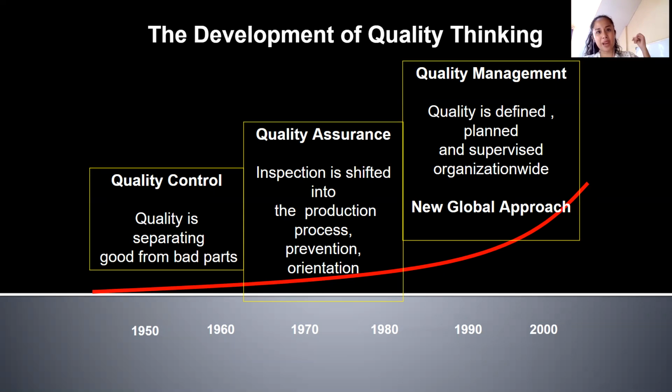You have to plan it, and you have to supervise it, so that everyone is working for quality. Syempre, 'di ba, garbage in, garbage out. And organization-wide. So, from the workers up to the top management, dapat lahat of quality. Ganyan na ka-intense ang quality ngayon, class.